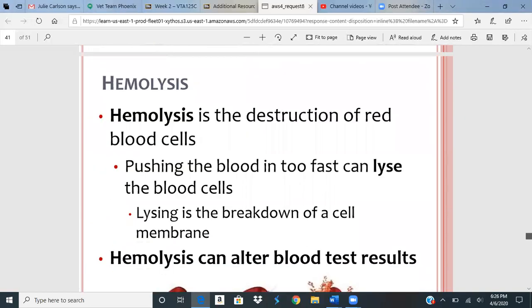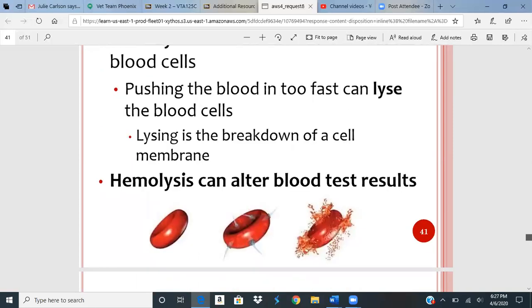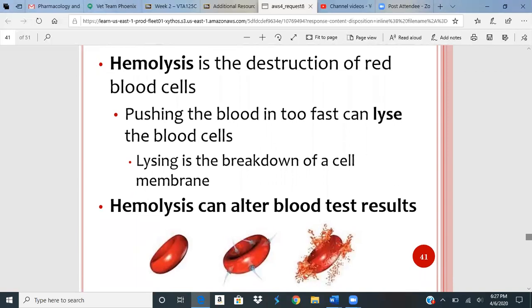Then hemolysis. Super important. You guys need to know this term. Means destruction of red blood cells. This is, let's say you put your needle into your tube and you push down. Well, now you've pushed all those red blood cells through that tiny needle and you're breaking them. You're essentially, like it says, lysing them. So hemolysis is you're breaking down all those red blood cells.